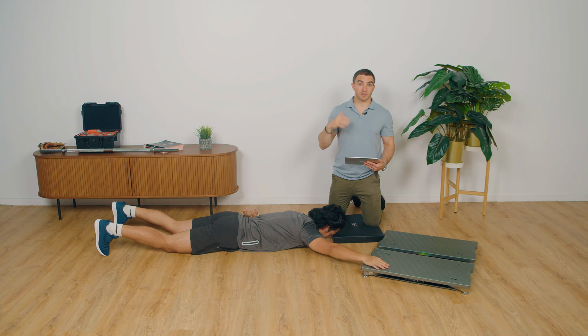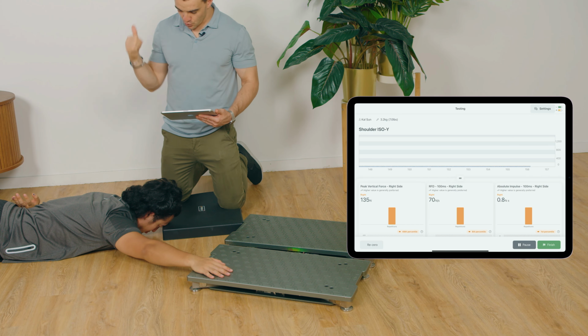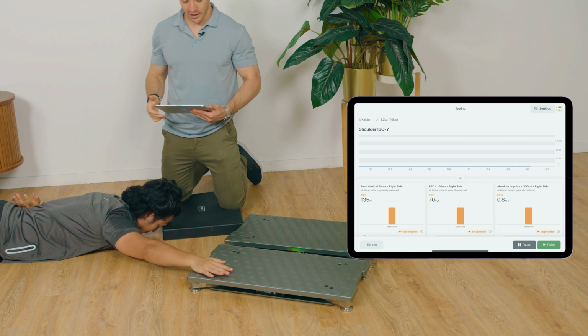Then what we want to do is look at peak RFD. So he doesn't need to hit the same strength value, but I want to see how quickly he can apply force when I provide him the cue to do so. So Cal, with this one, I just want you to apply force as quickly, as fast, as hard as possible in a nice quick burst. Hold, hold, hold, and then relax. All right?